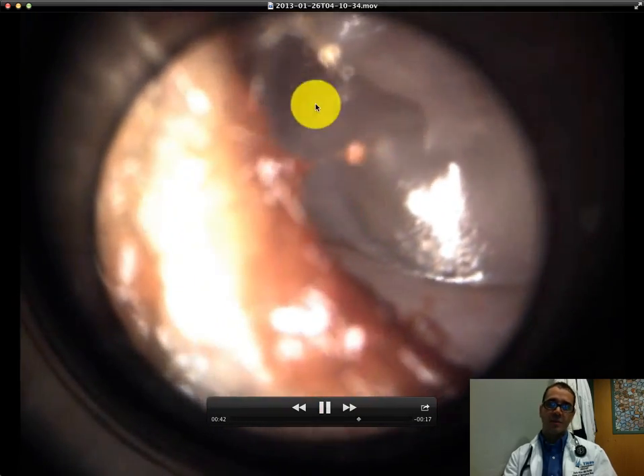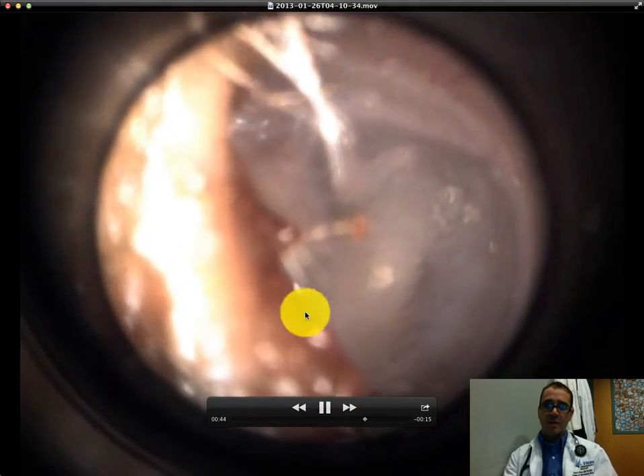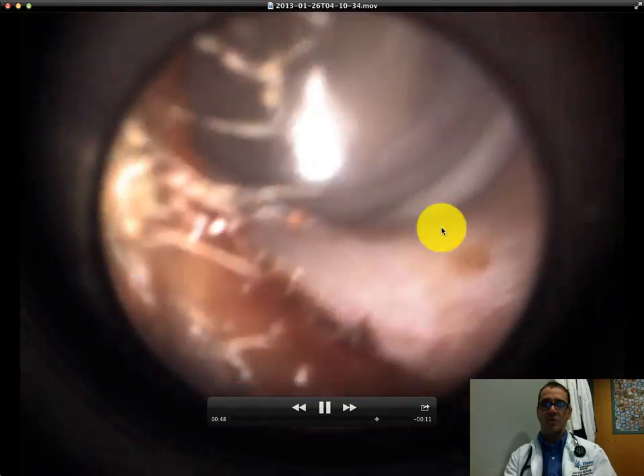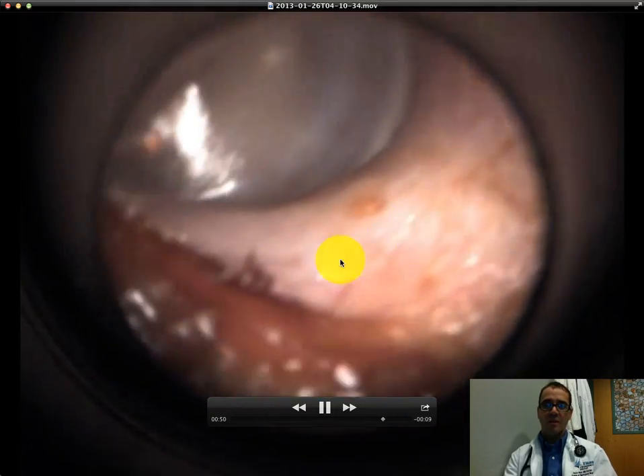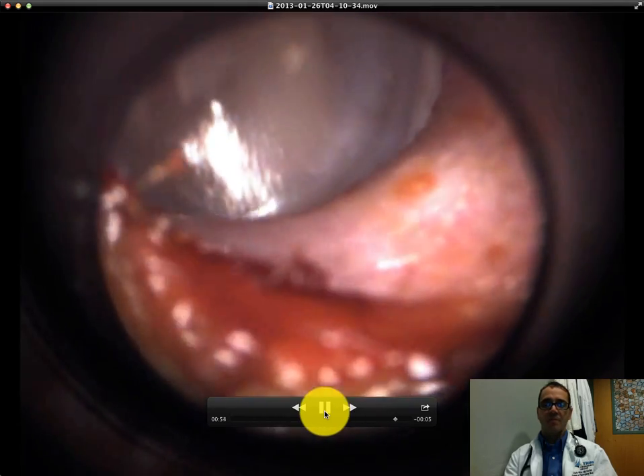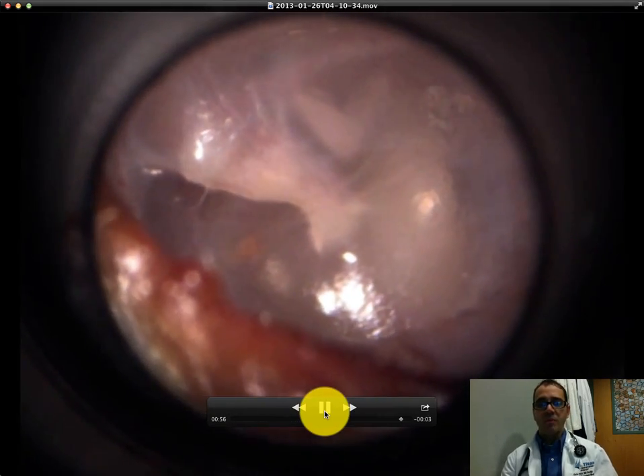Same thing, but this time the bone is this way. You can see the shiny reflex there. You can see the tympanic membrane is nice and pearly throughout. Again, some wax in the canal, but no foreign bodies or anything like that. So this is what a normal ear exam looks like.